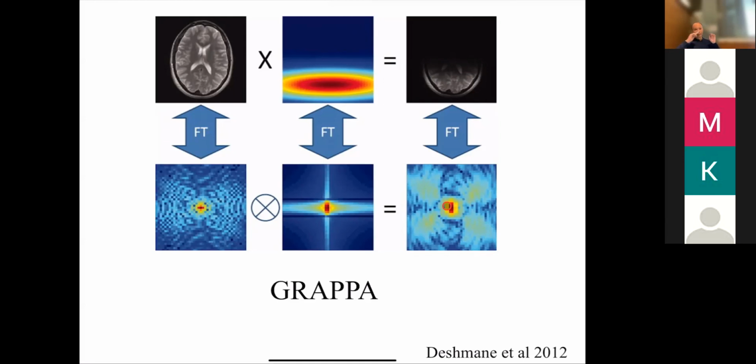So for your pre-lecture quiz, the intuition is to think about what happens as you make a coil sensitivity pattern smaller. Then remember that the kernel gets broader, which means your assumption of doing GRAPPA is better. Because if the sensitivity pattern is very big, then its Fourier transform is going to be very small, so the assumption of GRAPPA is going to be less applicable.